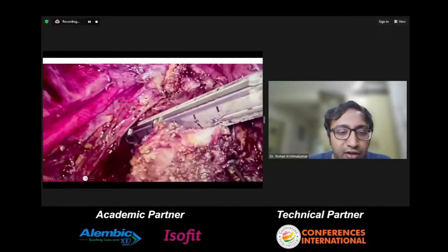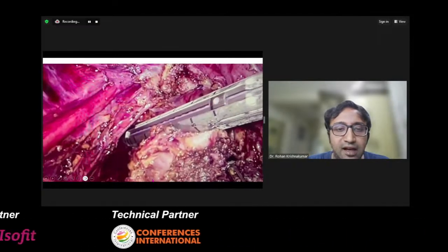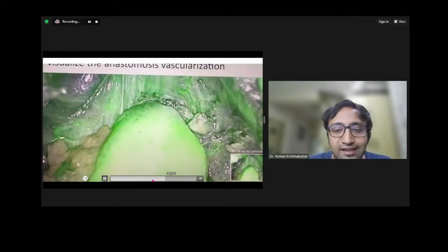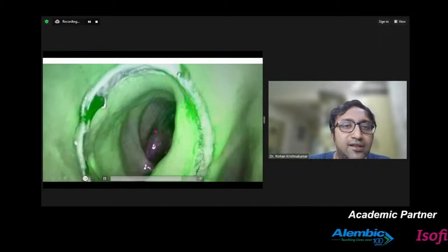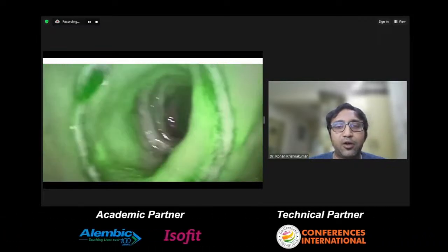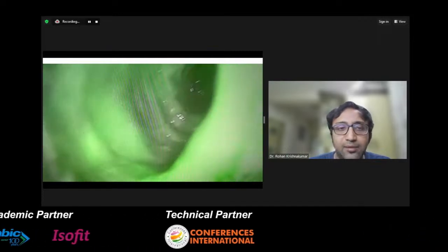Going further, this is after a case of bowel resection. I'll skip for being on time. This is after the colorectal anastomosis. You can turn on the ICG so that you can see any avascular areas. Also, while doing colonoscopy, this is the resection line from inside. You can see the ICG very clearly, and if required, you can take a stitch if there's any avascular area. So this is how it helps there.